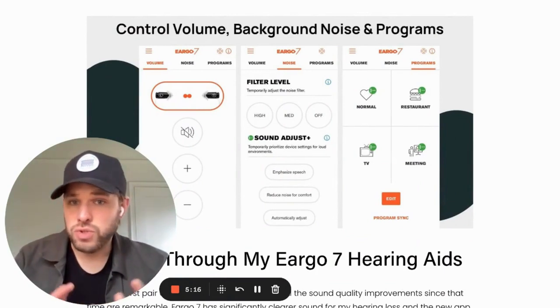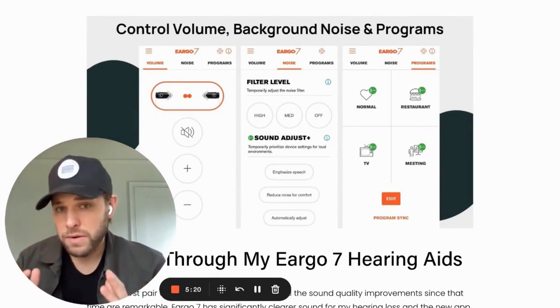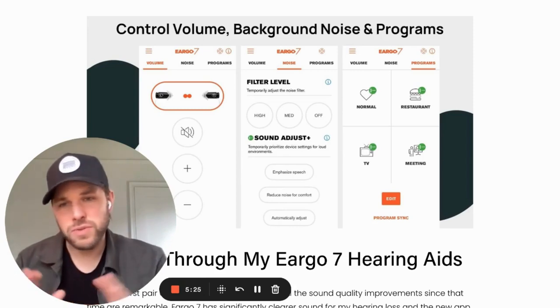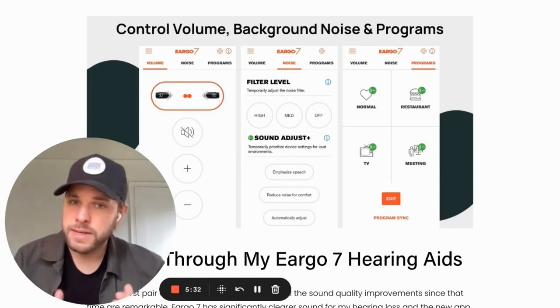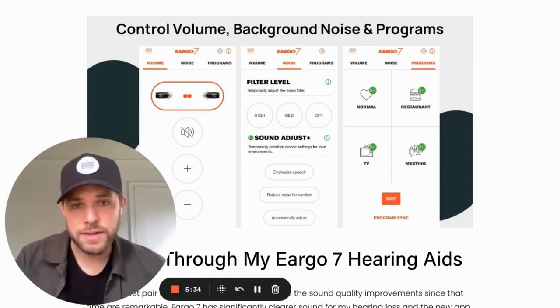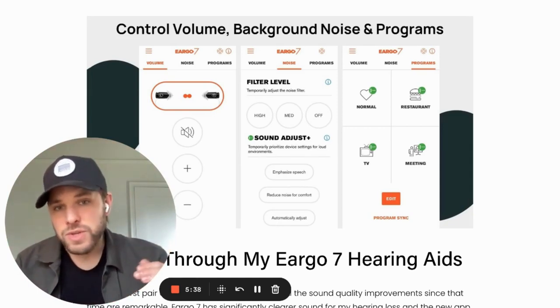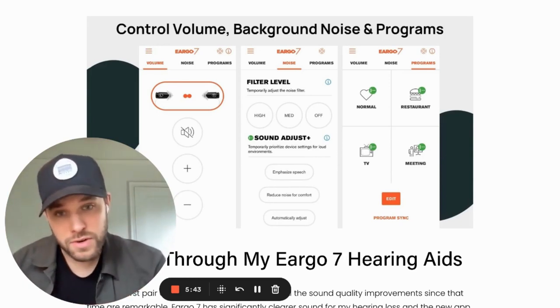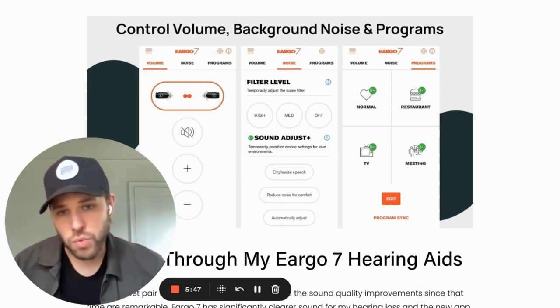The second screen controls noise — you have a couple of options: filter background noise high, medium, or off. I liked medium or high personally, to reduce static and background noise in my environment, though some people prefer a more open sound. Within sound adjust, you can emphasize speech, reduce noise, reduce noise for comfort, or put it in an automatic setting and let the hearing aids do the work for you.